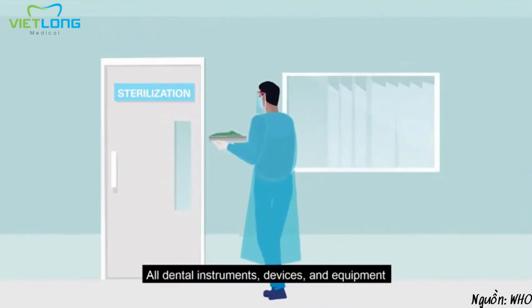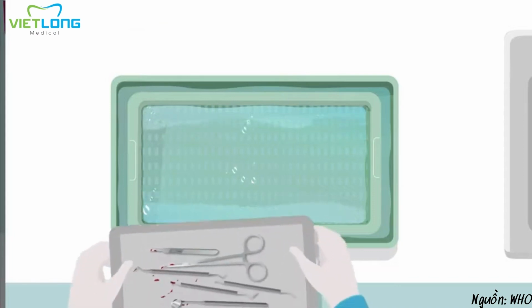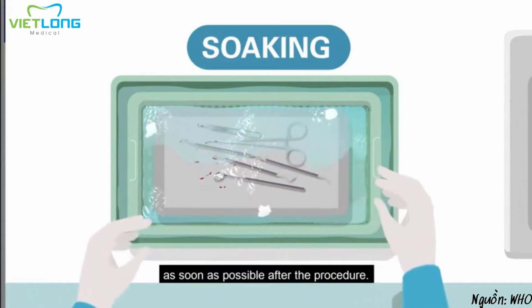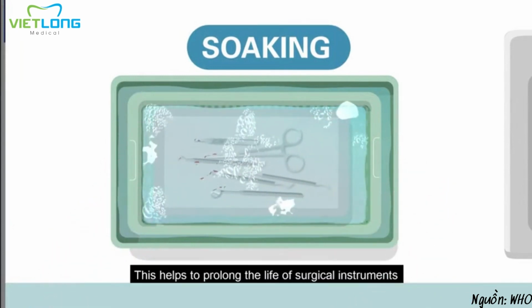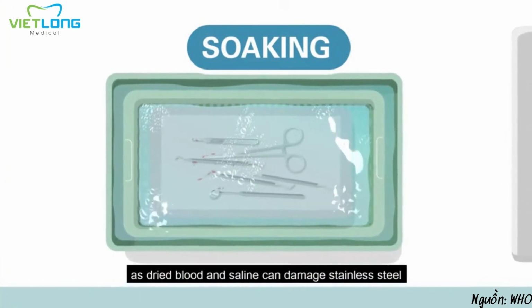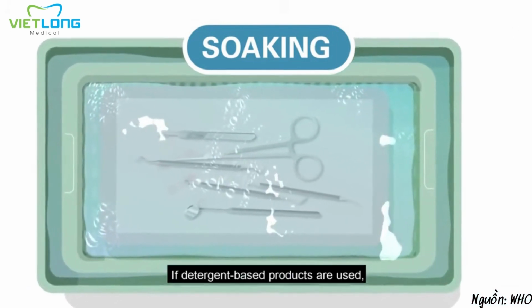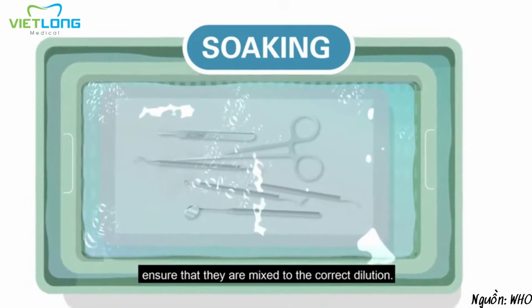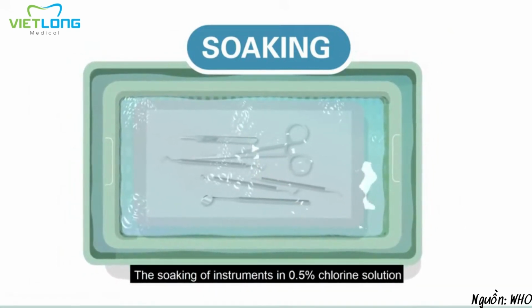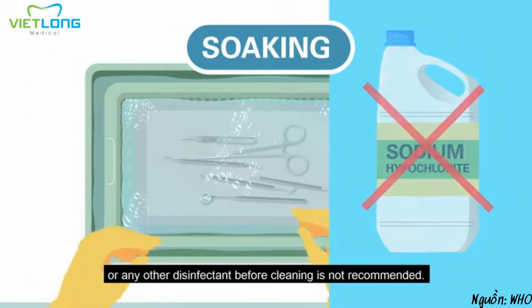All dental instruments, devices and equipment must follow all the steps of a processing cycle. The first step is soaking instruments in soapy water as soon as possible after the procedure. This helps to prolong the life of surgical instruments, as dried blood and saline can damage stainless steel and make instruments much more difficult to clean. If detergent-based products are used, ensure they are mixed in the correct dilution. The soaking of instruments in 0.5% chlorine solution or any other disinfectant before cleaning is not recommended.